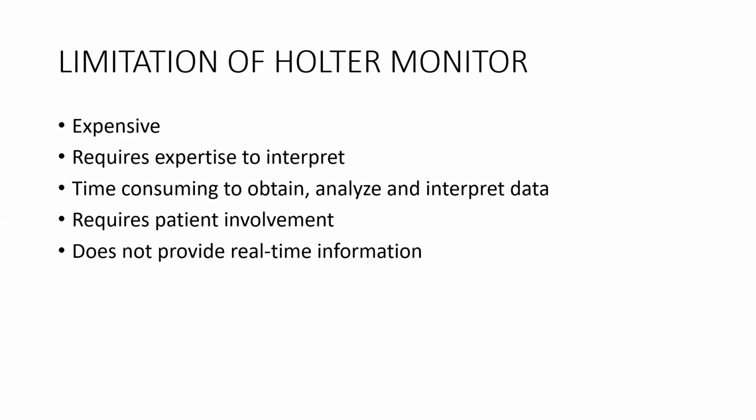Then the patient has to actively press the button to activate the machine. It has the ability of storing data for just 30 to 150 seconds and then subsequently transmitted for analysis.